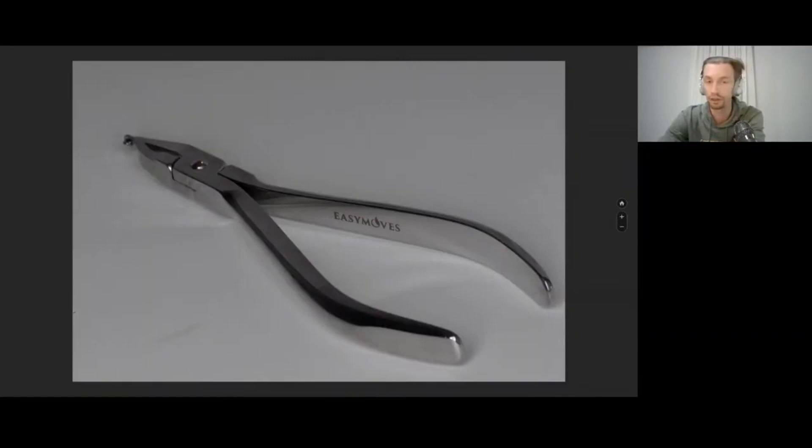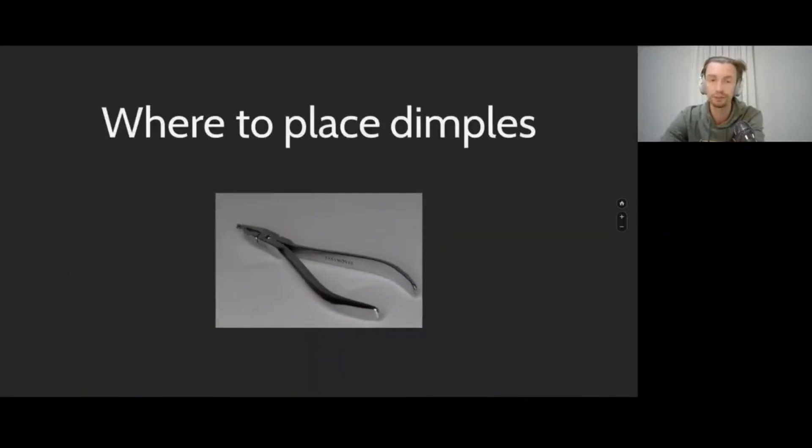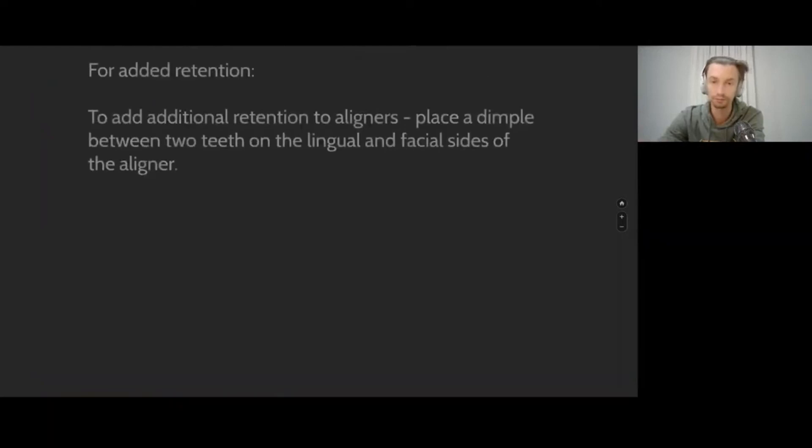I should mention I'm not working with other pliers that do cut-outs. There are thermopliers — these are not thermopliers. These are simple pliers that mechanically deform the aligner, creating certain notches inside them.